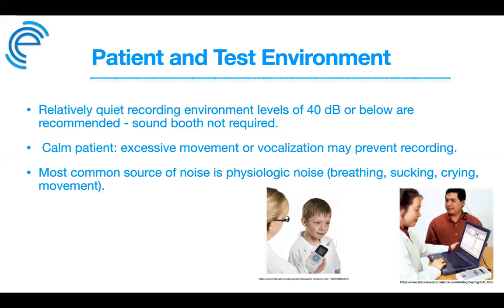Another issue with OAE testing is that it's very sensitive to physiologic noise, which is low frequency: breathing, sucking, crying, movements, and all that. This also applies to someone with a respiratory illness, for example wheezing or a lot of coughing, which can also be an issue for the low frequencies. The last comment I want to make about this is, to avoid electrical artifact, to have the probes and the cables separated.